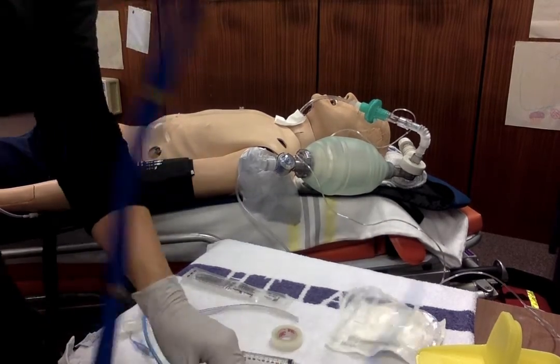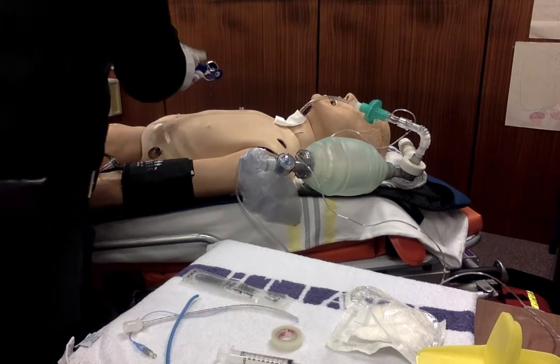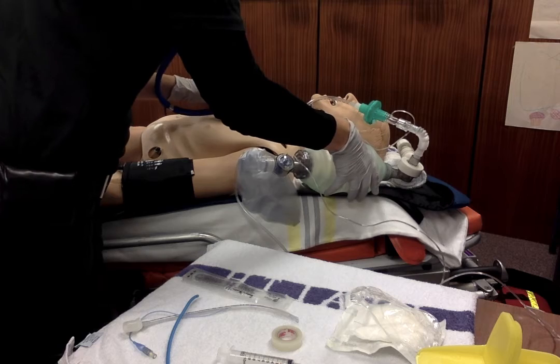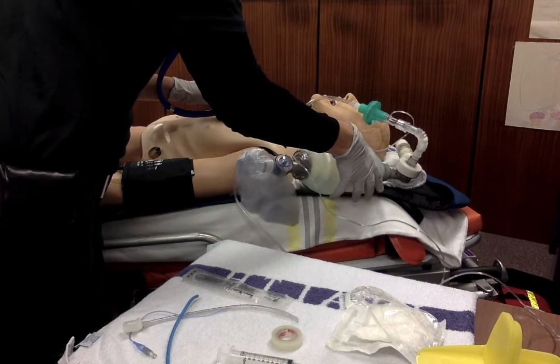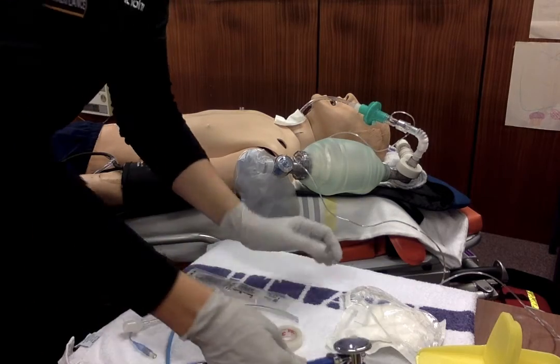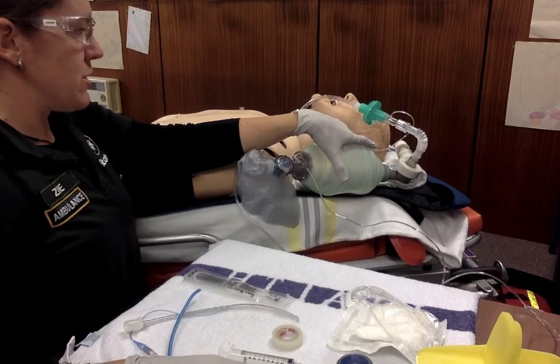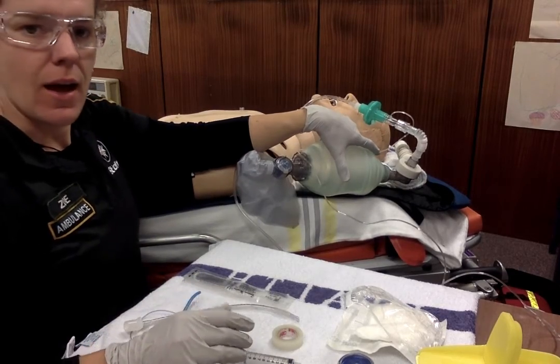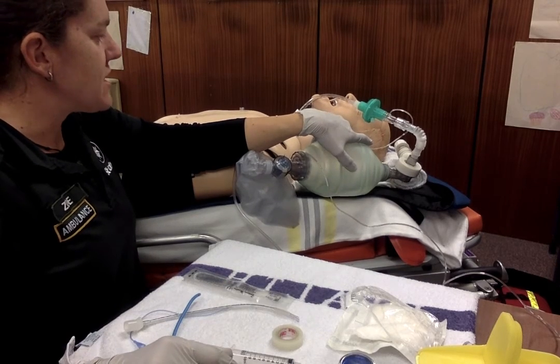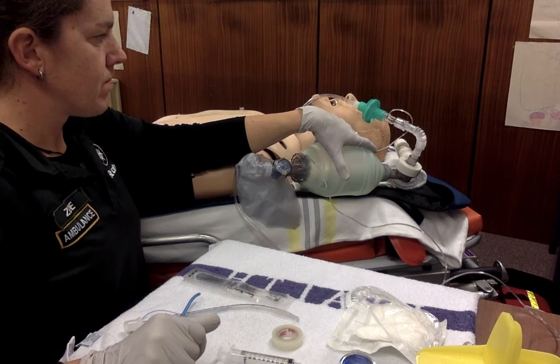And then double check that you've got good air entry, having a listen on both sides, and having a look at your capnography waveform and your pulse oximetry to see if you've got an increase or reading from those, and then ventilate them as appropriate. Take to hospital.